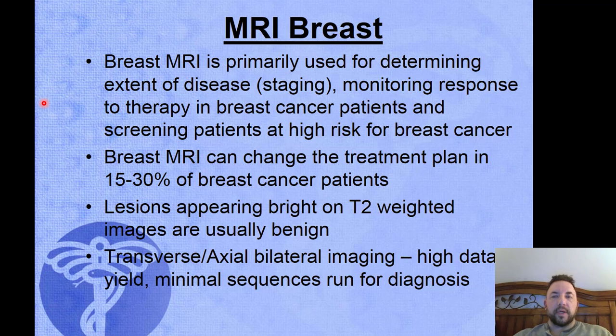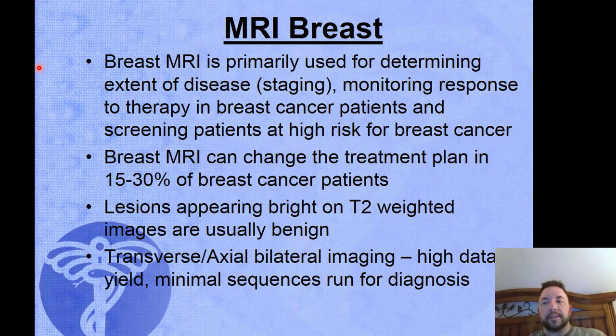Women diagnosed with dense breast on mammography can now have ultrasound and MR with better insurance approvals. Only in the last year or so has there been less utilization of MR of the breast, because it is a very expensive diagnostic modality.